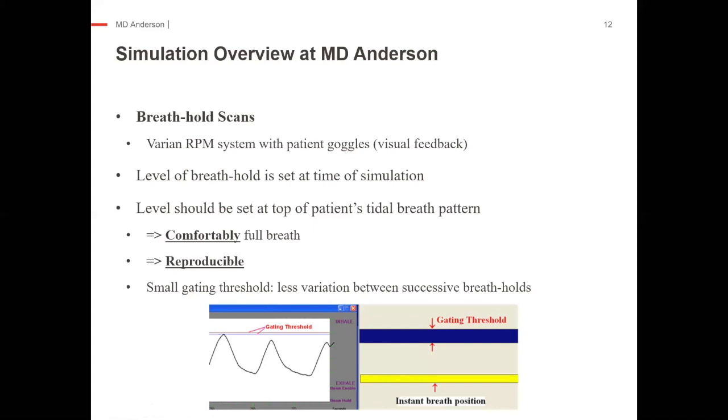And you want to set the level just at the top of the tidal breath pattern. So you don't want this to be a deep breath in. You want it to be a comfortably full breath. So this helps make it reproducible. It keeps the patient from moving or arching their back, that kind of thing. And it's, like I said, more reproducible from one day to the next, as well as from one breath to the next. We're going to set our gating threshold.